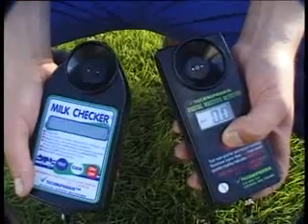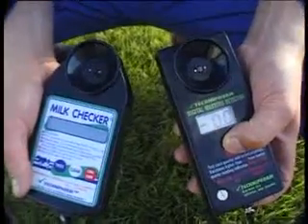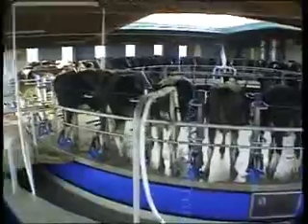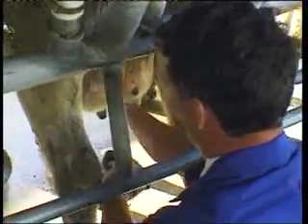A Technifarm mastitis detector or milkchecker will identify mastitis early and accurately. Early means long before telltale mastitis clots appear in the full milk. Accurate means subclinical mastitis — an infection which does not give any visible signs of inflammation and therefore cannot be recognised by the farmer without the digital milkchecker.